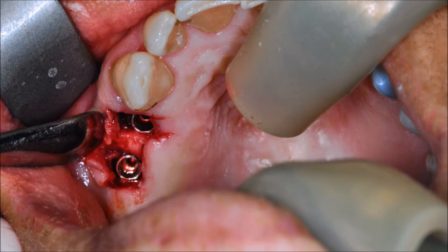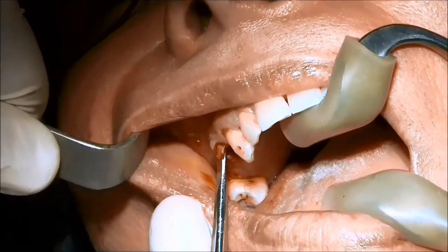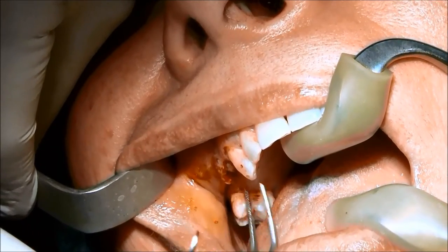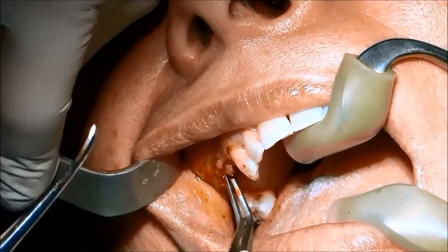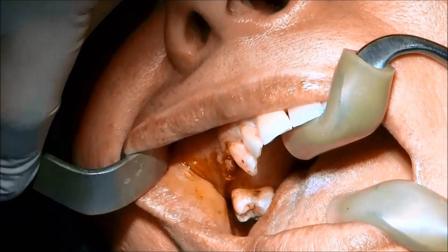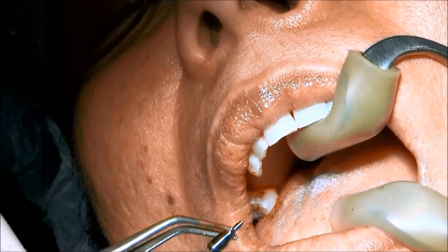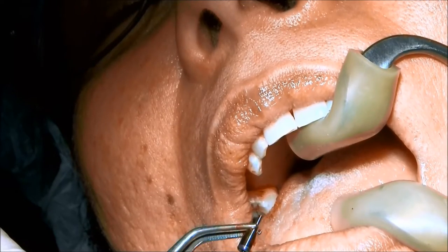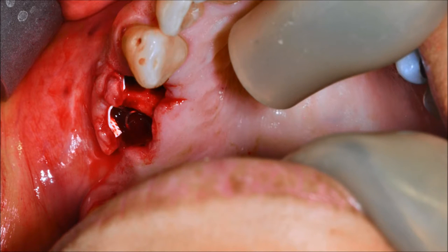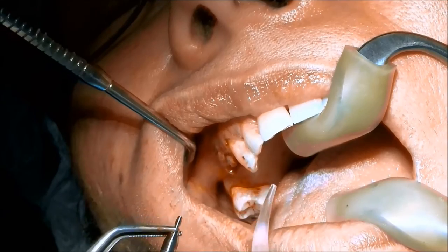I'll share with you the pictures showing the position of the implant, and you can see that we are in place. The palatal wall was left. Here we are placing a healing abutment. This picture shows the membrane position on the facial aspect.